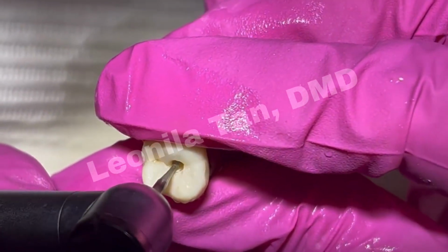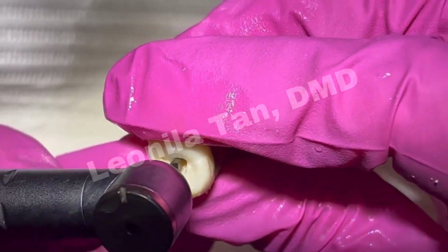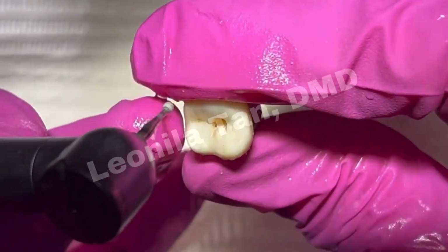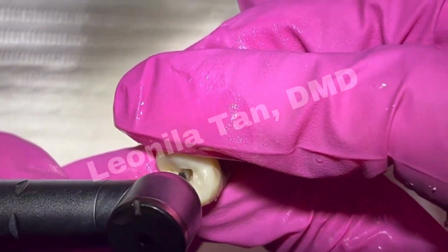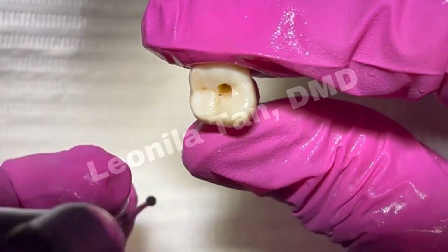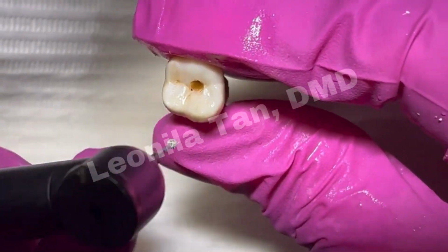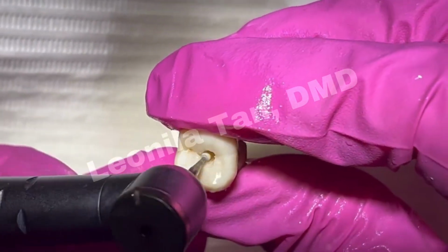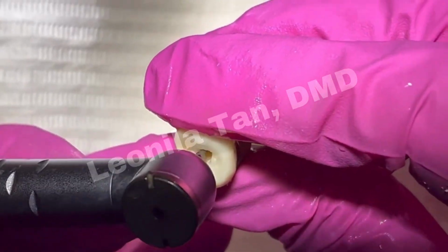Again, you only enter once and you do the unroofing motion towards the buccal. Let your round burr just go in where that drop was and move outward. Never do a flattening motion. It's always an outward motion with the burr. All you have to do is follow where the burr catches and go outward.